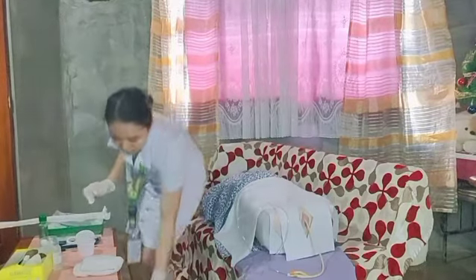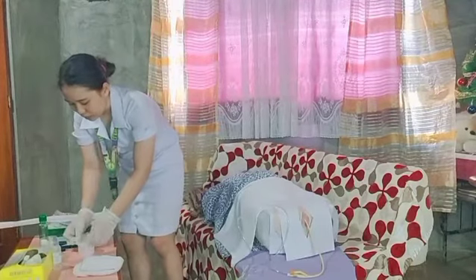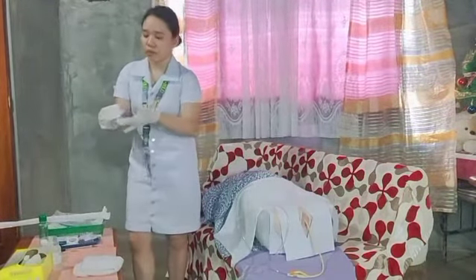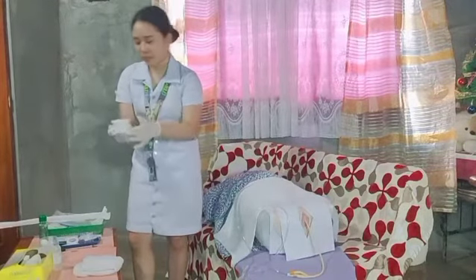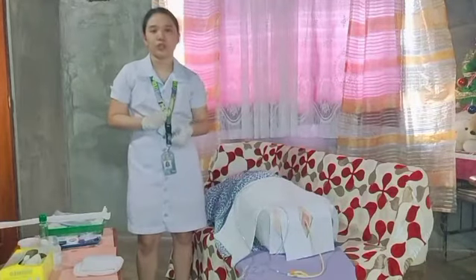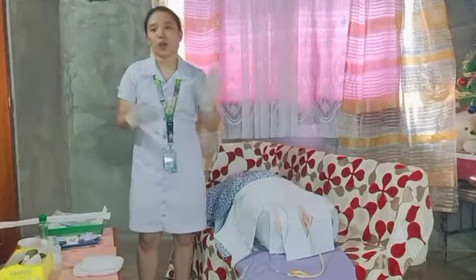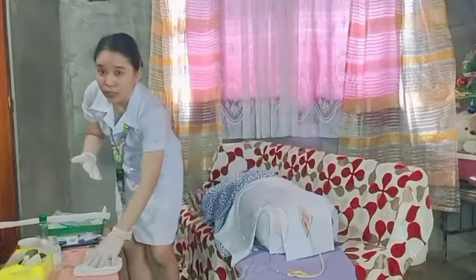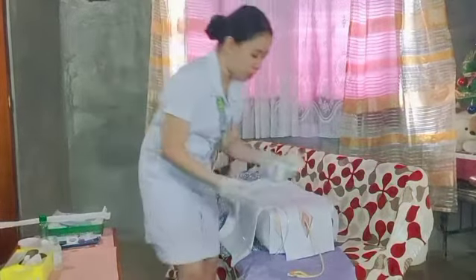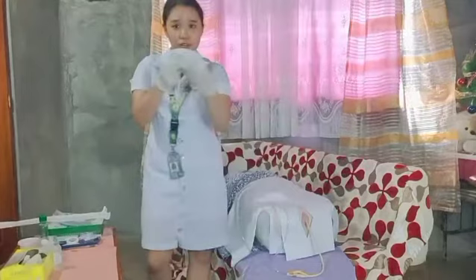Then discard. And then also, we need to put the name of the patient here in the cup. After getting the urine sample, of course, you should also clean again the urine port with wipes. So you will get a new wipes and then clean again the urine port. And discard it.